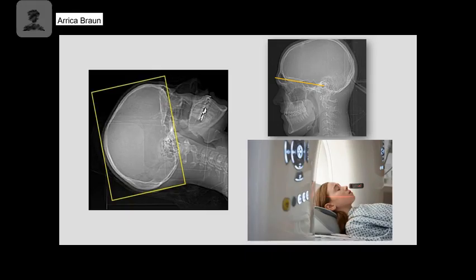Okay, so here are a couple examples. When we have the patient lay down, their head will be in a head holder. Once we do this, we then can kind of position the head, have the patient tilt, or have the patient pull their head back. So with this patient, just what I'm seeing there, the SOML would be pretty close.